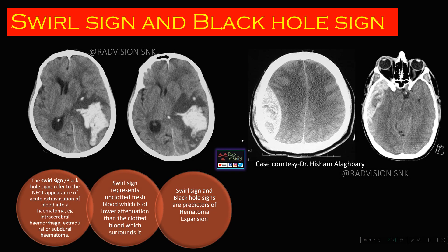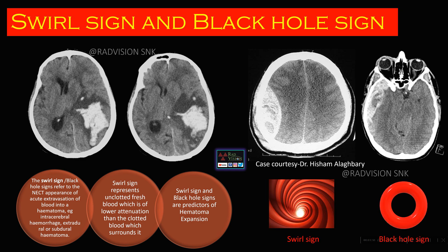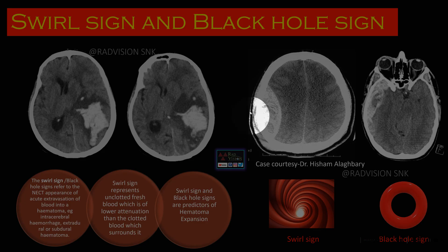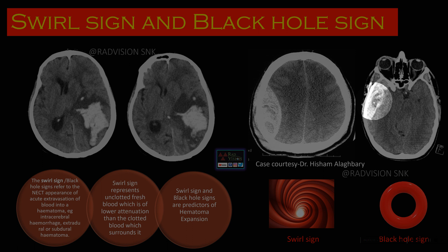The swirl sign and black hole sign are typical predictors for hematoma expansion. The swirl sign can be seen in intracerebral hemorrhage, EDH, and HDH as shown in this series of cases — thanks to Dr. Hisham for contributing the EDH case. In the swirl sign, the hypodense and hyperdense areas mimic swirls or waves. Here you can also see a small black hole inside the peripheral hyperdense hematoma.